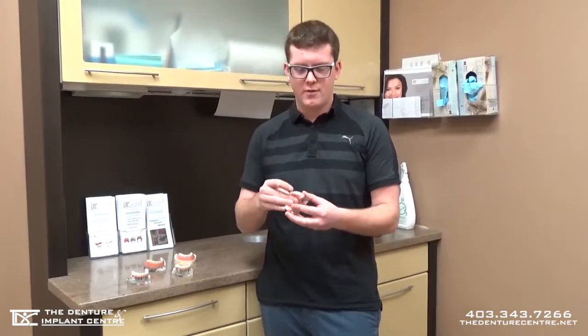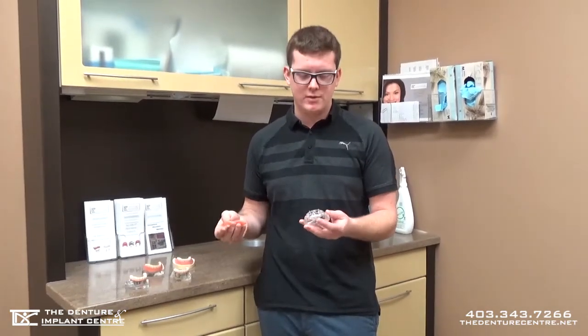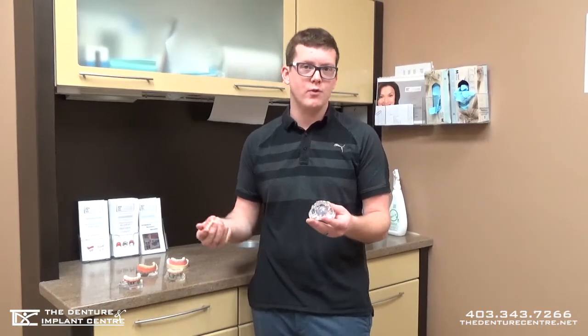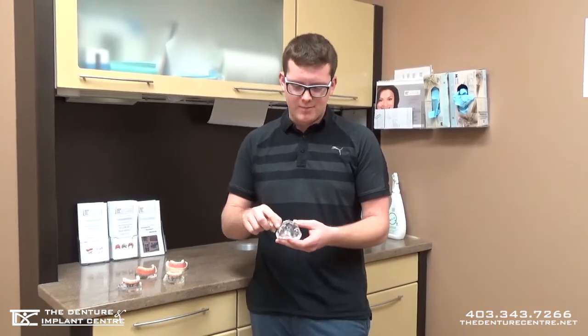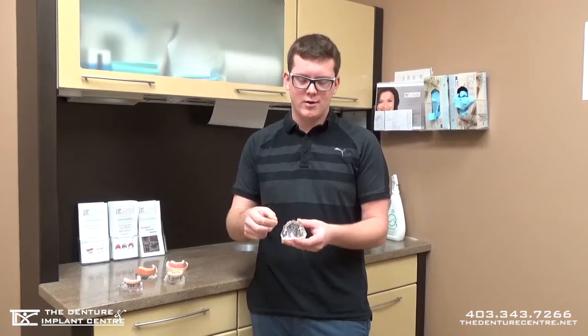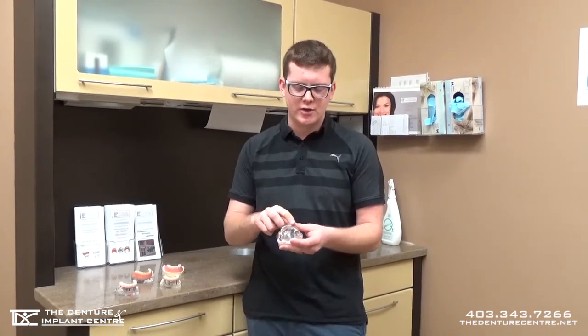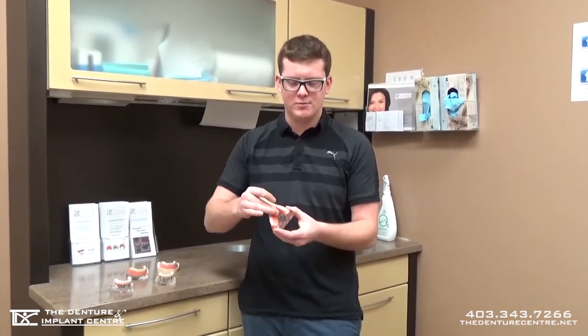First off, there's what we call locator dentures. Basically there's two to four implants with little locators, which are basically little buttons that attach to those implants and stay on your gums. Then there's little buttons within the denture — the denture snaps right on and stays on there.